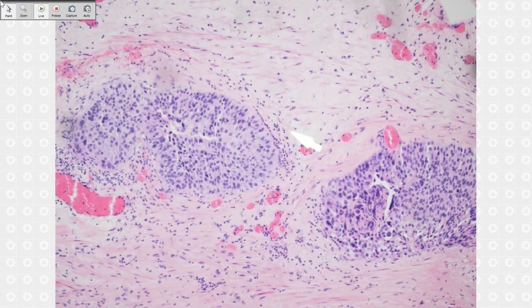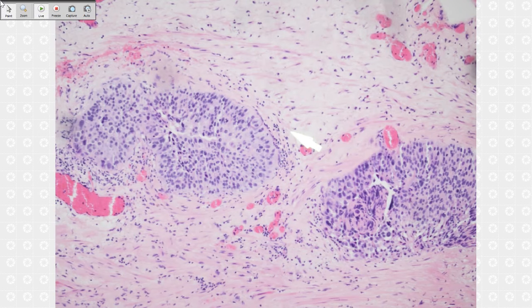Sometimes it may be difficult to tell. Basically, urothelial carcinoma spreading into the prostate along the prostate duct is not a T4. You still base the stage on the bladder, so they don't call this T4. Even if the bladder has urothelial carcinoma in situ, I still call it Tis, because there is no invasion at all. T2 should involve the muscle layer, right?